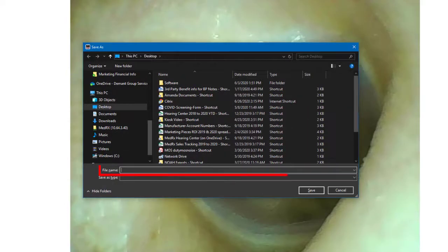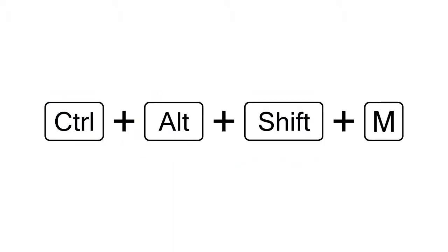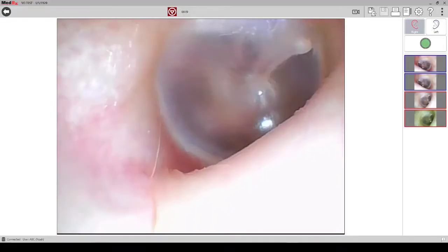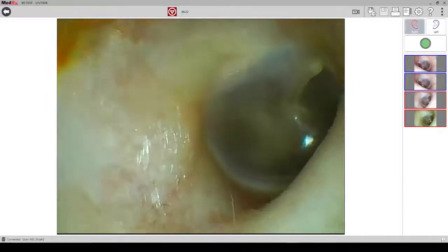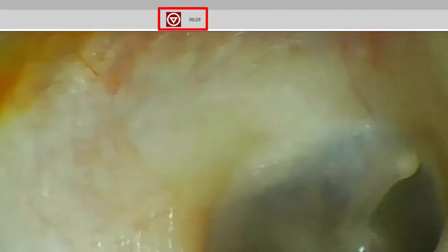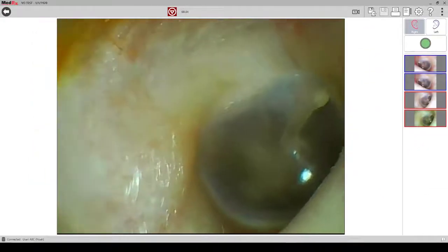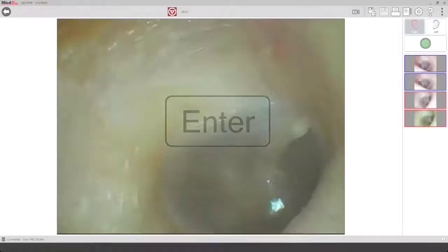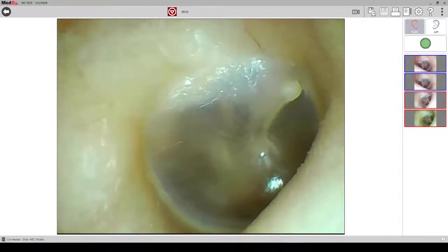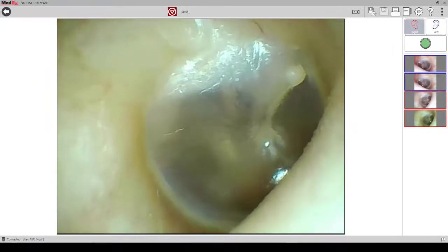You can name your file and save it to your desired place on the computer and it will save it as a JPEG. To record live video with your video otoscope, click CTRL-ALT-SHIFT and M at the same time on your keyboard. The recording will begin automatically and at the top of your screen you will see the red symbol along with the running clock of your recording. When you are finished recording, you can either hit the space bar, the enter key, or the camera button on the video otoscope. It will prompt you to save the file and name it to any location you would like on your computer.